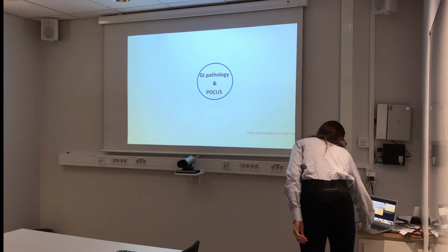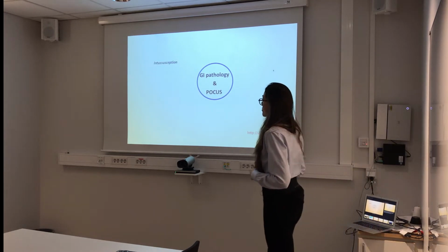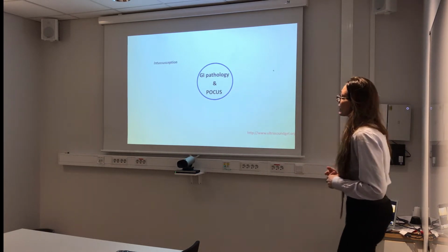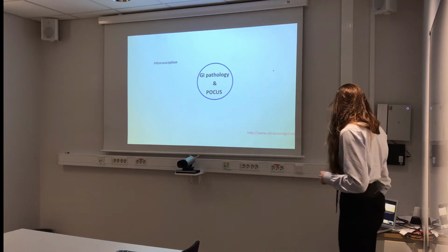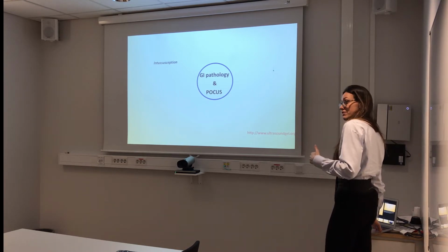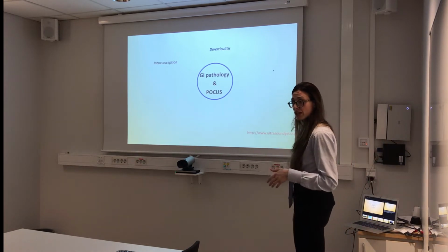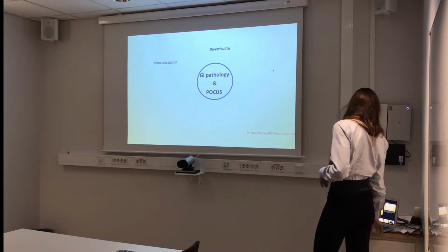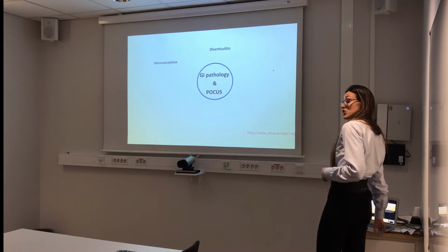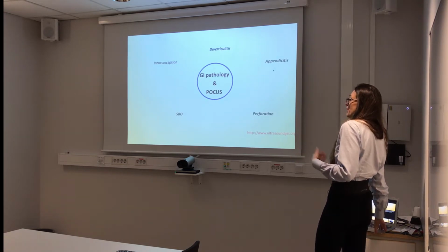What we can see is intussusception, which is regarded as a kids' pathology, so it's mostly in children. According to the epidemiology it is something that you see in kids, but intussusception can be related to the SBO as well. So you can have an SBO secondary to an intussusception. Diverticulitis as well. This is not the day we are talking about it, but we can see diverticulitis very well. We can see perforation in the diverticulum with the point of care ultrasound because the sick bowel is lying very superficial. Then appendicitis that we all know, and then SBO, small bowel obstruction, perforation as well.